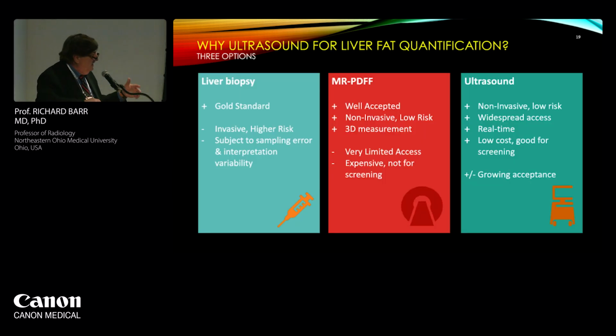Now, just briefly, liver biopsy has been the gold standard. But again, we can see changes dramatically. If somebody fasts, their liver fat can change in a month. So we can't biopsy everyone monthly to see what's going on. So it's really not a very good gold standard.